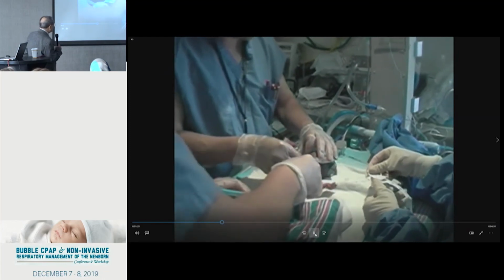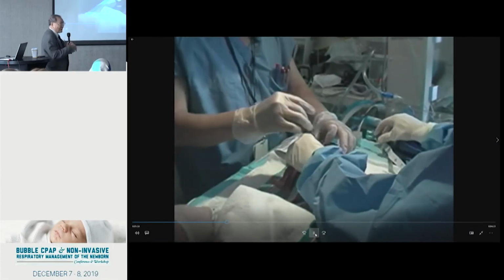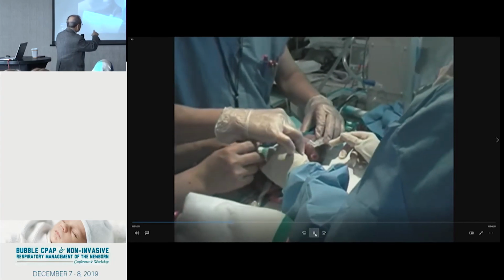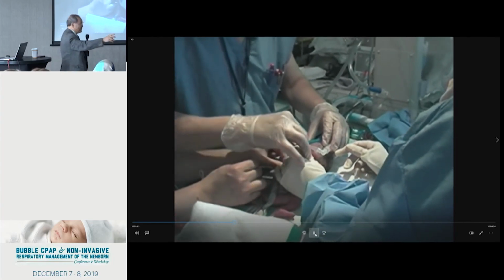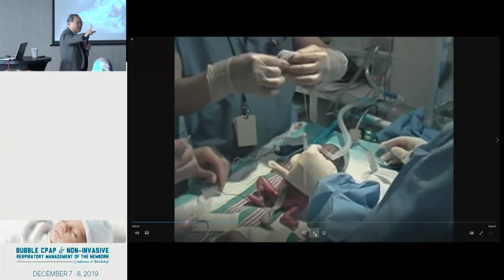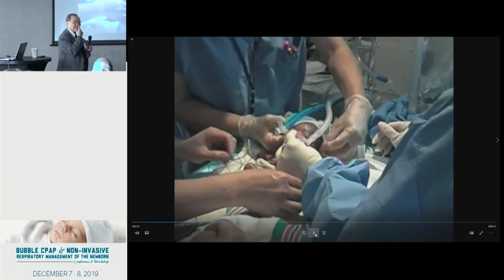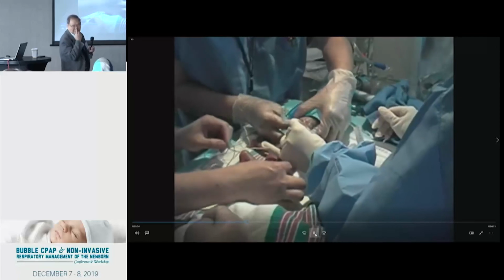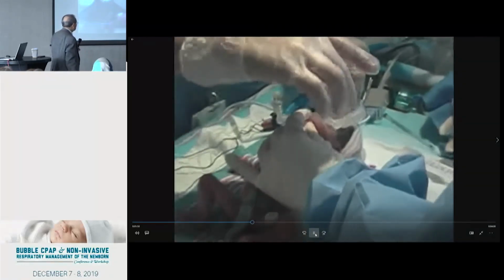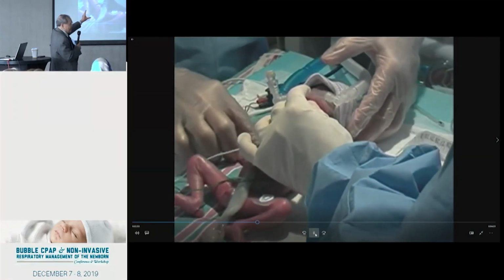Okay, all right, so you quickly dry the baby and you put a CPAP plug on. All right? So now you're going to put a hat so this may come out, right? You just ask anybody, an assistant, a resident who went to the delivery room, to bring the baby here. So I ask him to hold the plug. All you need is 3 fingers, okay? Thumb and the index, middle finger on the chin, and just on the plug. Baby moves, just stay with the plug so you can fix the head. Okay, see this resident, 3 fingers, right?